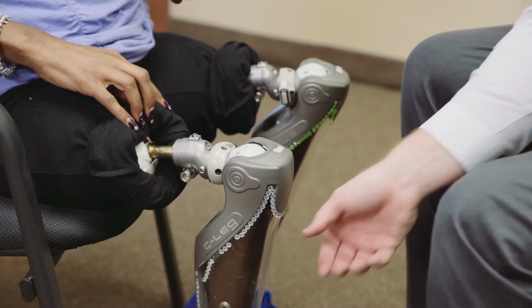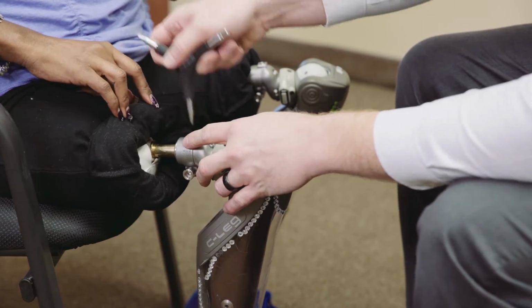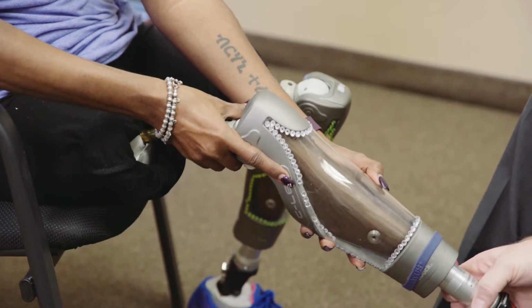Another process that may need to be done from time to time is changing the bushing. This can be necessary if the shear pins have broken away or if there is some loosening due to the shear pin rubbing loose. In order to change this, the locking screw holding the tapered sleeve and bushing must be removed.